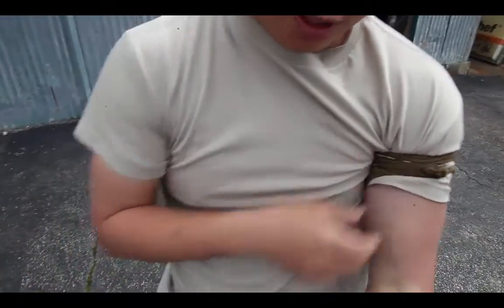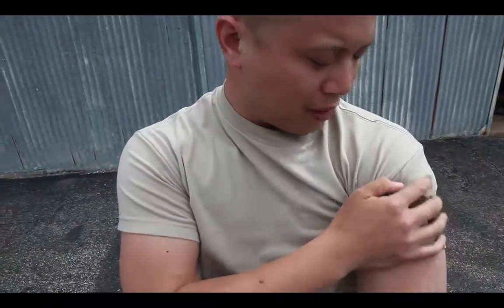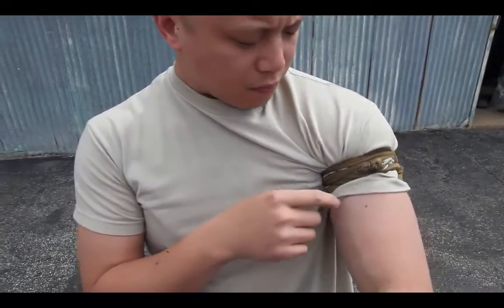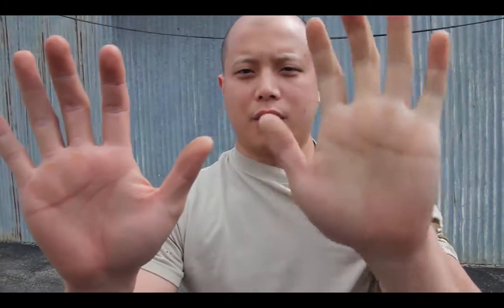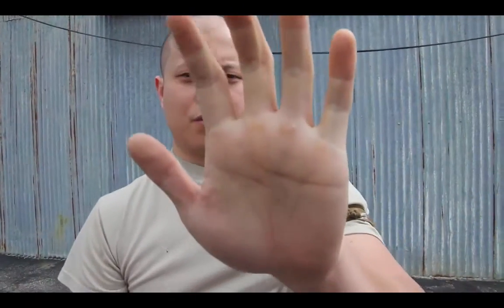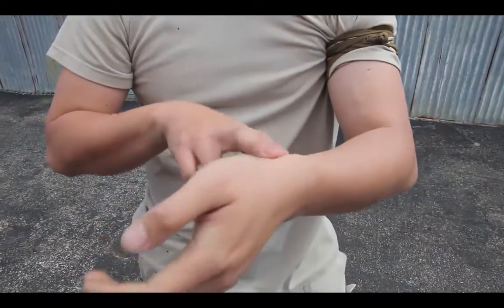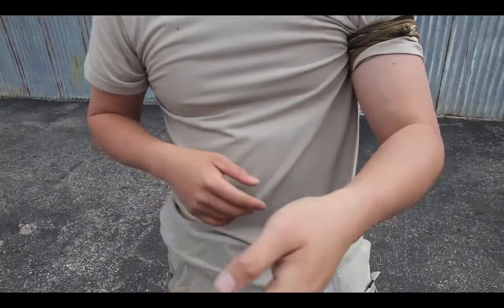Two easy ways to test that blood flow is being occluded: if you look at my hands, you'll notice my left one is turning a different color — pinkish versus almost a whitish color. You can also check for the absence of a pulse. If you barely feel or feel zero pulse, that's a big clue that blood flow is not going to that limb.